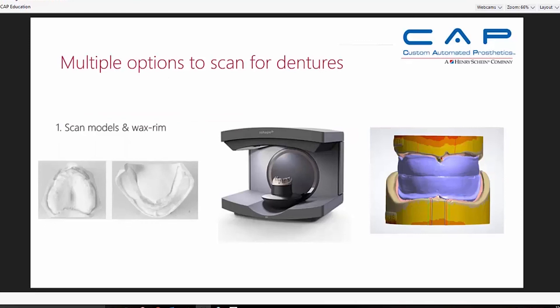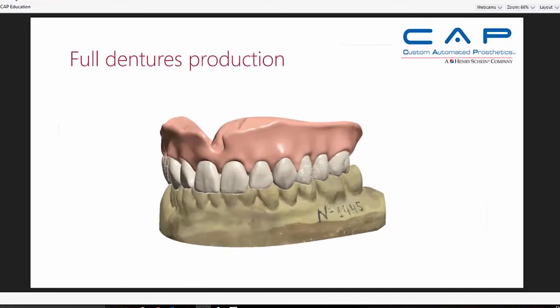Here we have multiple options for scanning for full dentures. Obviously we're going to scan models and wax rims that have had marks put on them by the dentist. This is a new E-series 3Shape scanner. It's really a matter of taking our analog steps and bringing them into the digital realm for our design process.